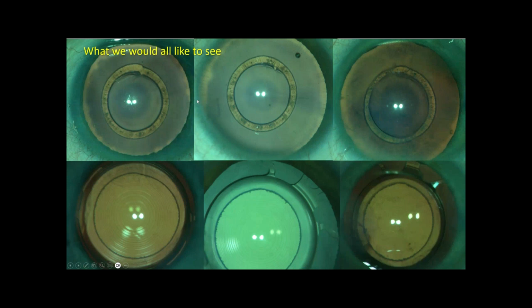What we'd like to see, of course, is a nice capsulotomy centered on your Purkinje image or your Trypan landmark or on the pupil, and all yielding a nice IOL centered on the capsulotomy. In the study, we had a small number, about 5% of eyes, that actually achieved all 3 criteria. Interesting. So there are obviously some very symmetric eyes out there, but it's not every eye. And I think we need to look beyond the 5%, at the 95%.